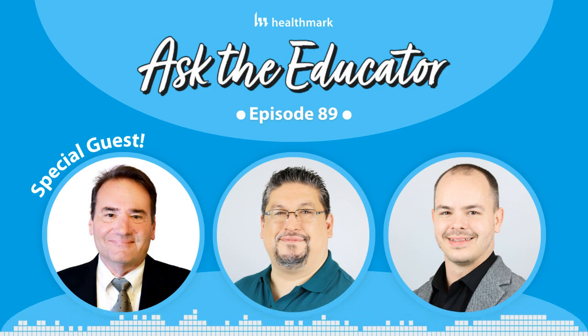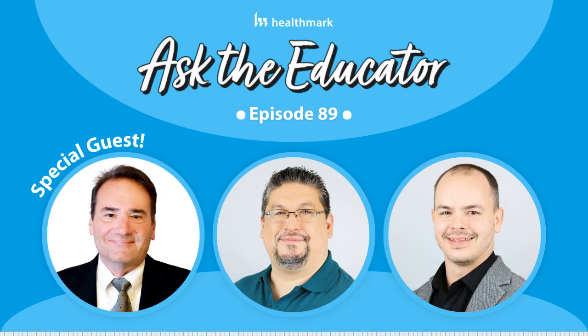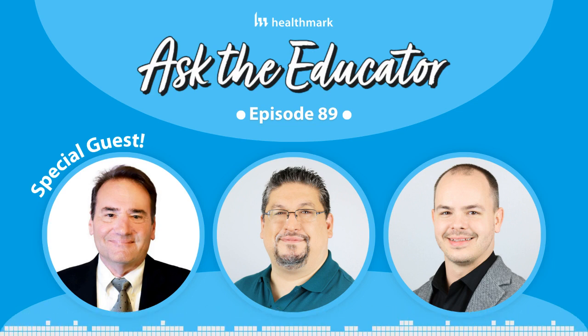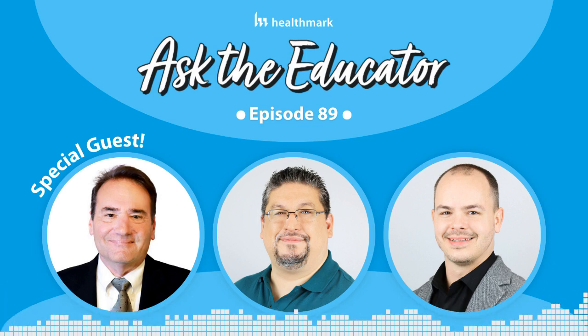As a device manufacturer, I'm not going to give you the worst case in the IFU. I'm going to recommend the best scenario, or the scenario that's most likely to achieve the goal. But I have to have tested it. So it's going to be the same steps, but I might recommend 2 ounces per gallon rather than 1 ounce per gallon, because I know your chance of being successful is even greater at that. But that's in my IFU. That's not in the validation testing.